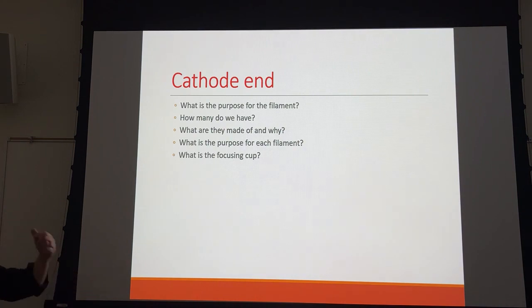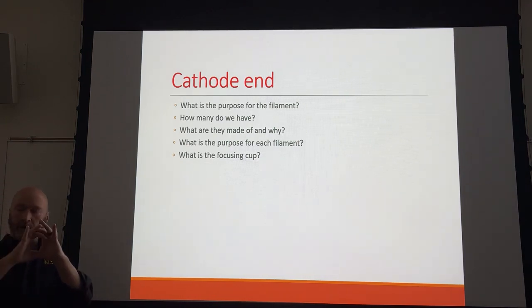So I think I recommended this last semester. If you go into clinicals tomorrow and it's kind of slow, go into your x-ray room, turn off your phototimers, and set your technique. Select the small focal spot size, that's the button that looks like a small box inside.